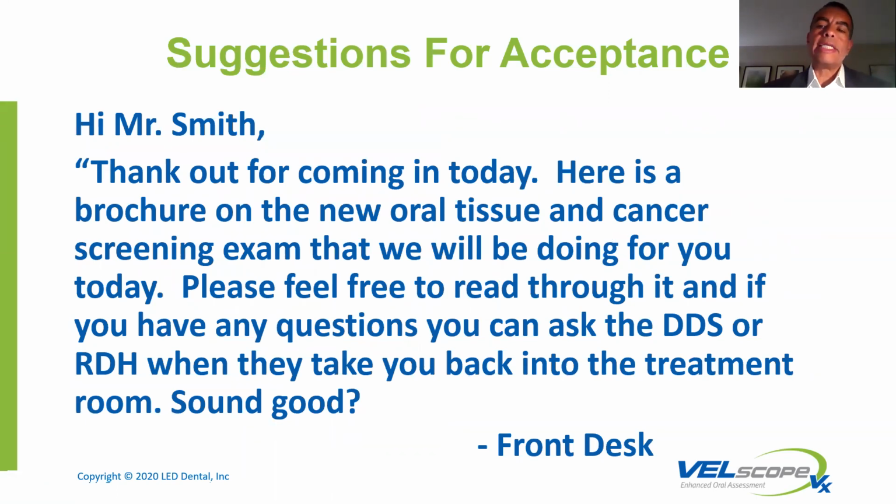But at the end of the day, presenting something to the patient: Mr. Smith, this is something that we're going to be doing today, something the doctor wants every patient to have because we care about you and your health. Please take a second to read the information. And if you have any questions, you can ask the doctor or hygienist when you go back. Okay, so now instead of reading People magazine or looking at the phone, they're reading the short brochure that talks about HPV, which they're learning about for the first time, in the connection between oral cancer. The fact that it's painless, it's fast. So one of the benefits is it actually answers a lot of questions that they may be asking in the back, which saves time for the hygienists, who predominantly are the folks that do the initial VELscope exam.